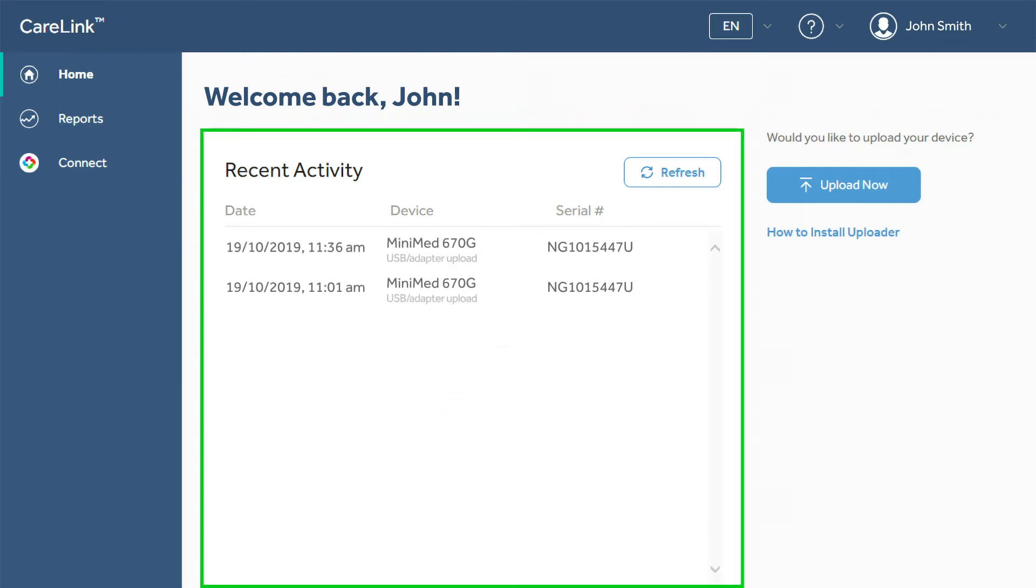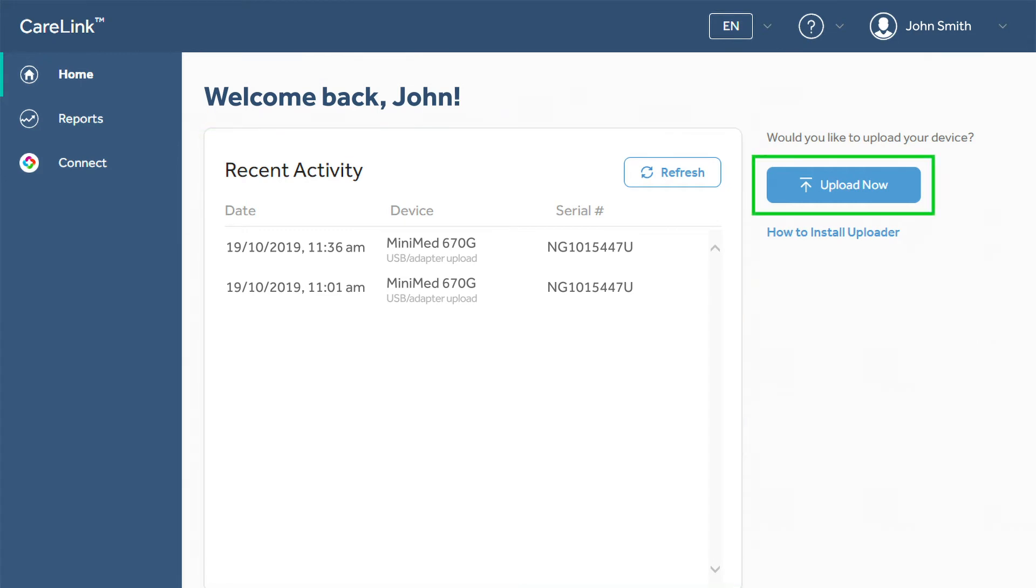The home screen shows your devices and recent activity. The upload process starts right from this screen. For more information about uploading data from your pump or meter, review the video Uploading to CareLink Software.